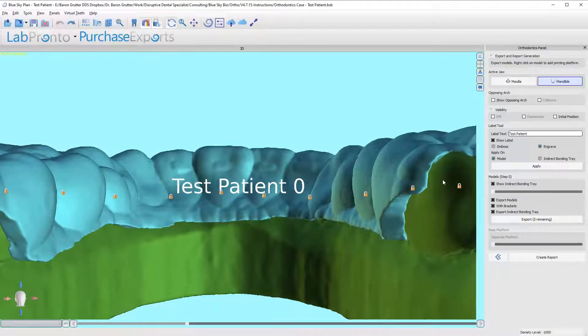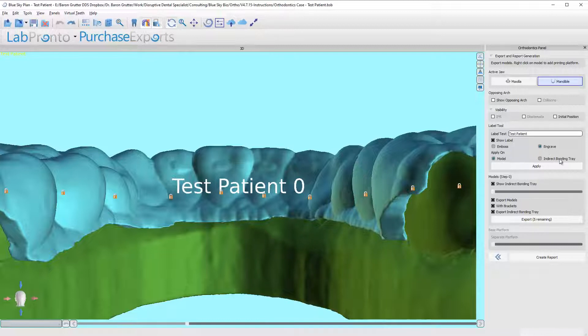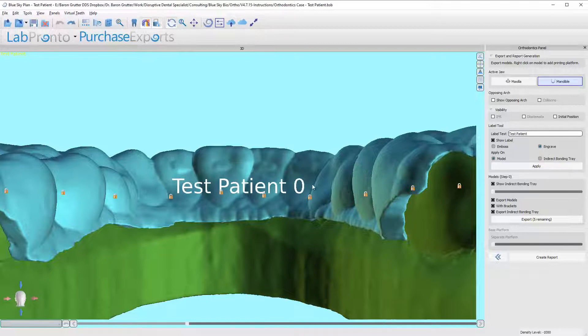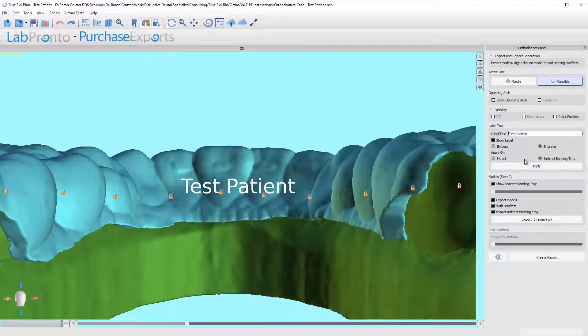Just make sure though—right now it thinks it wants to apply the label to the model because right here it says apply on model. So you want to change it over to indirect bonding tray. Notice that the number disappears and now shows no number because it's just the tray itself. So we're going to click on apply.